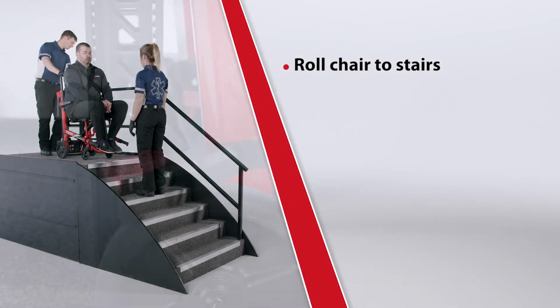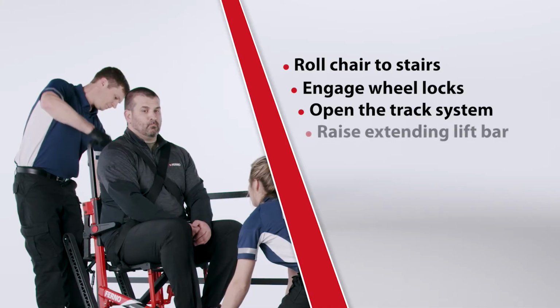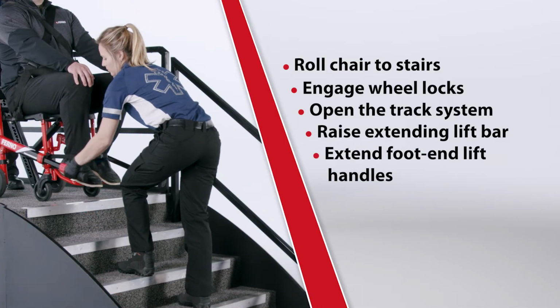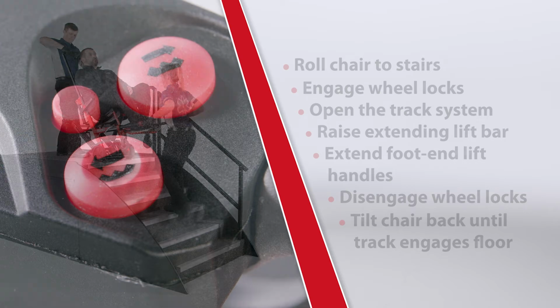Roll the chair to the stairs and engage the wheel locks. Open the track system and verify it has locked. Raise the extending lift bar. Extend the foot end lift handles. Disengage the wheel locks and tilt the chair back until the track belts engage the floor.